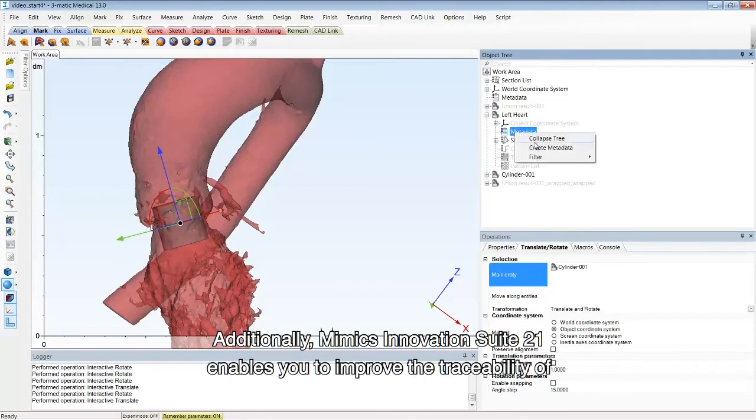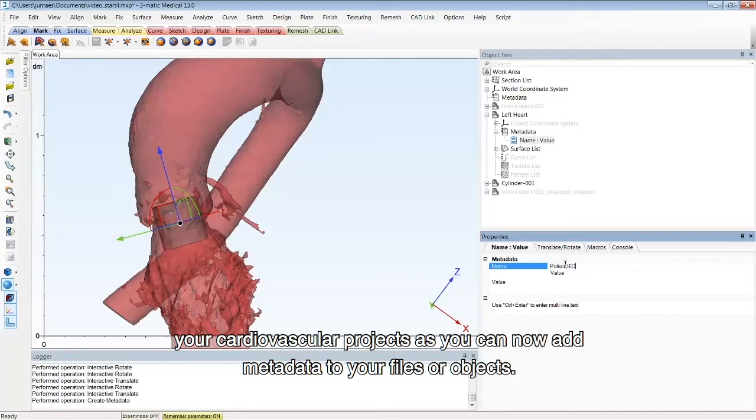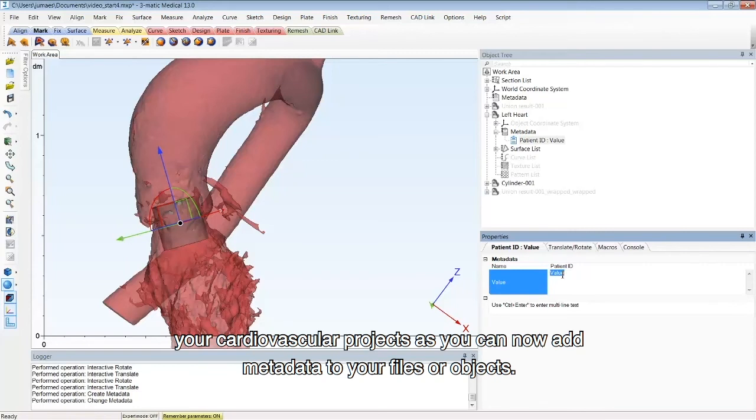Additionally, Mimics Innovation Suite 21 enables you to improve the traceability of your cardiovascular project, as you can now add metadata to your files or objects.